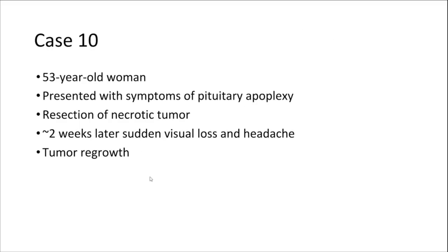Okay, this is now the final case, case 10. This was a 53-year-old woman who had symptoms suggestive of pituitary apoplexy. This is many times an emergency. The patient had a resection of this necrotic tumor, which was felt to be probably consistent with an adenoma. But 2 weeks later, she presented again with sudden visual loss and headache, had very fast tumor growth, and went for a second surgery.